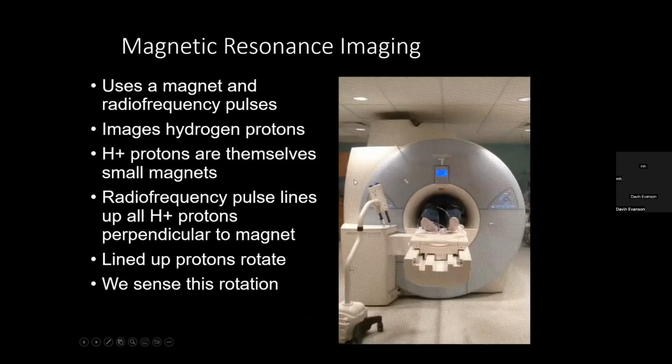Okay, let's switch gears, go to MRI. And basically the patient is going through a big magnet. Lots of physics here. It's going to be 1.5 or 3 Tesla usually. And what we're trying to do is to use the hydrogen spin. We want all the hydrogens either going up or down, and realize the hydrogens, whether it's with water, fat, protein, tumor, whatever, will have a different local environment.